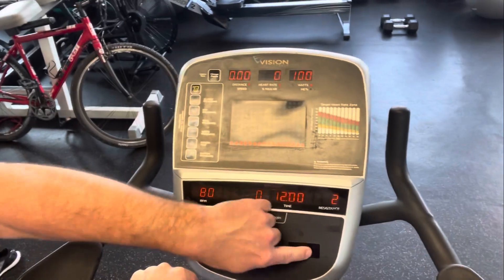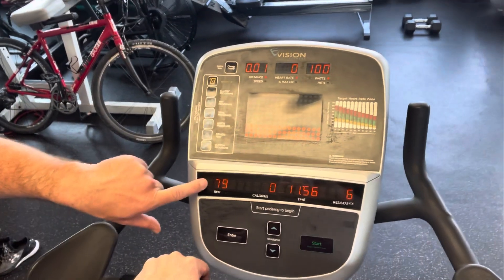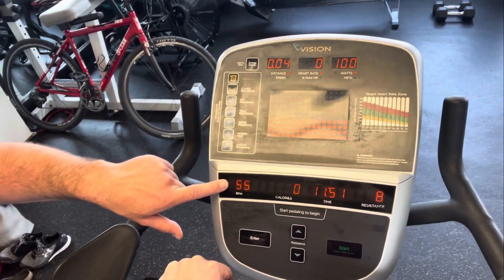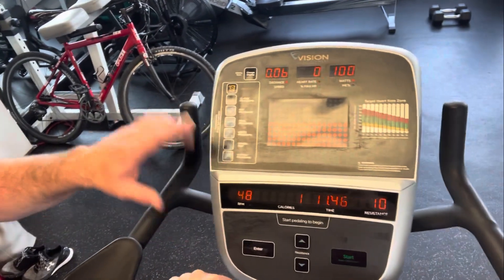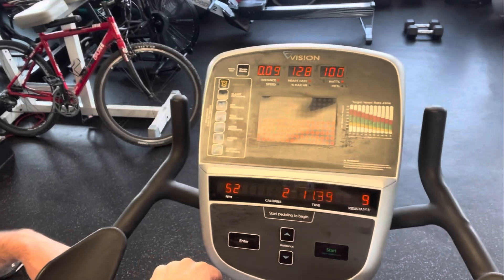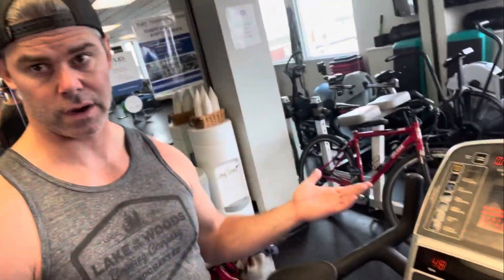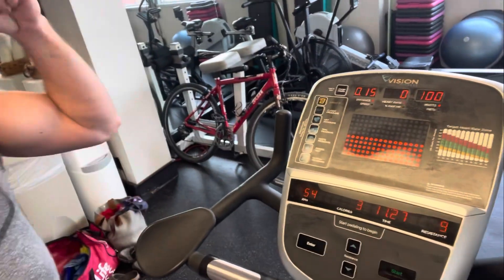Select a wattage — it's going to be the same wattage for the first six minutes — and press start. The big thing is the RPM has to be around 50. That's the protocol. It'll be unfamiliar for a lot of people because it's pretty slow for a bike. Try to keep that cadence. You can use a metronome app set to 100 — there and back equals 50 RPM — to help the client keep pace.